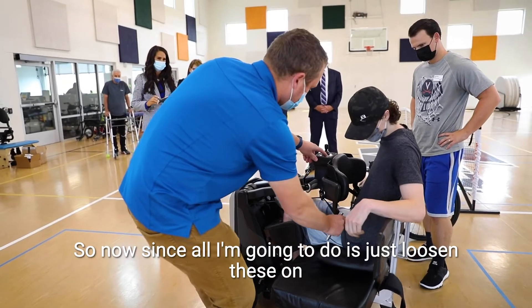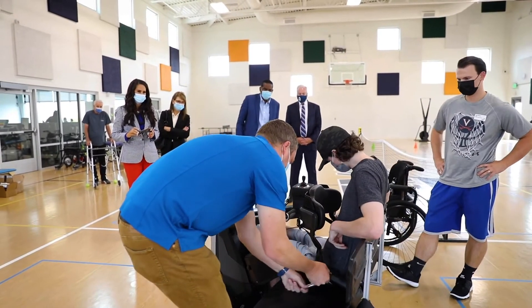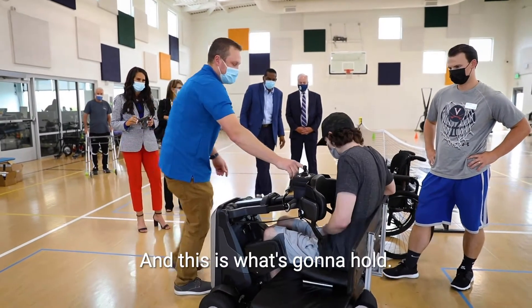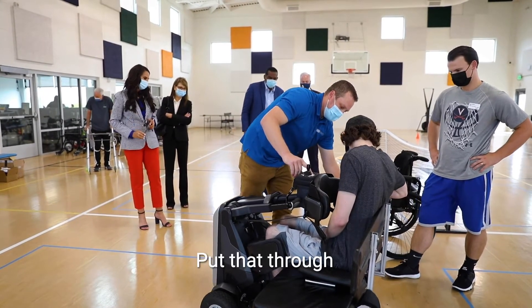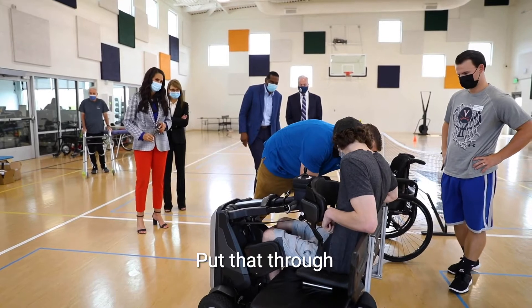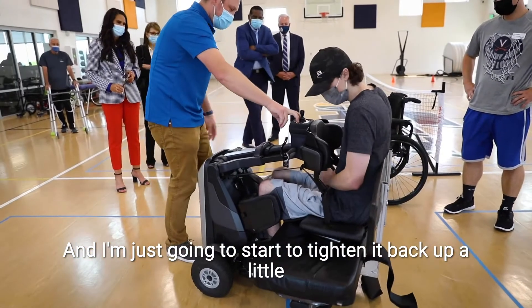All I'm going to do is just loosen these on both ends. These are going to go through here, and this is what's going to hold you up. Put them through these toggles and then cinch up and take it — thread that through.